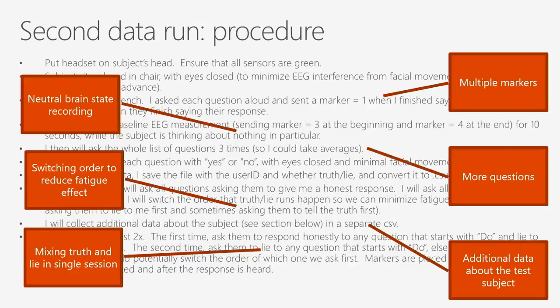Because even over time, the same person, if you test them in the morning when they first wake up versus after they've had their coffee versus when they're tired versus when they're drunk, et cetera, you're going to get different results. So being able to handle all of those cases is another thing I'm thinking about.